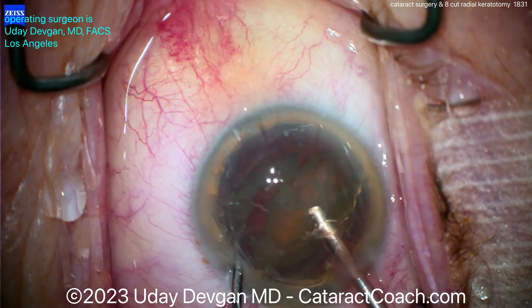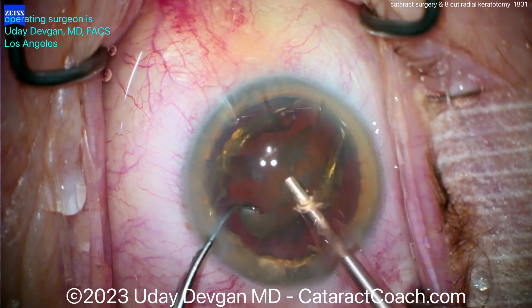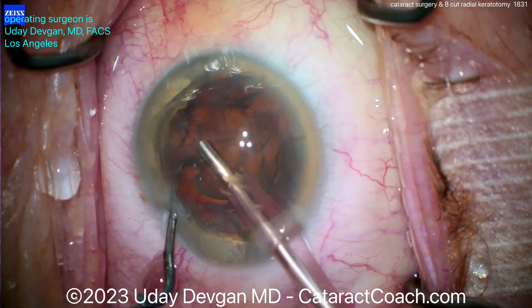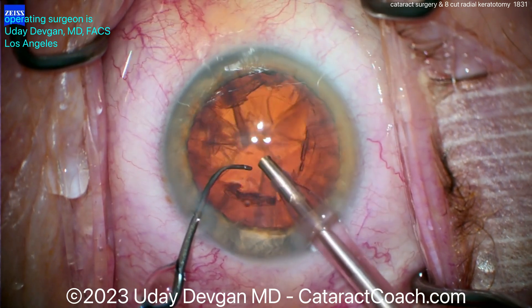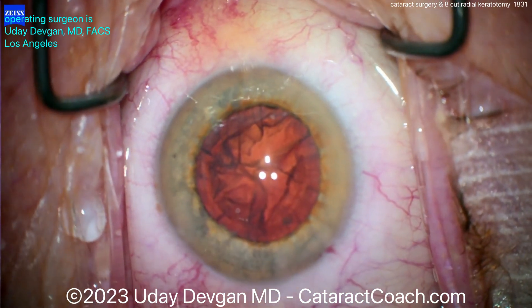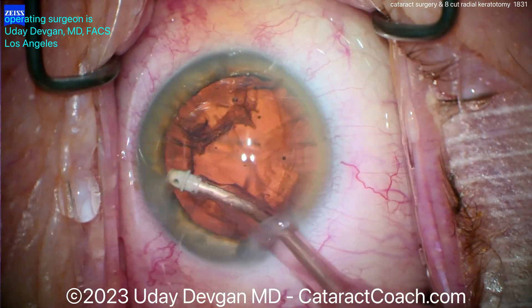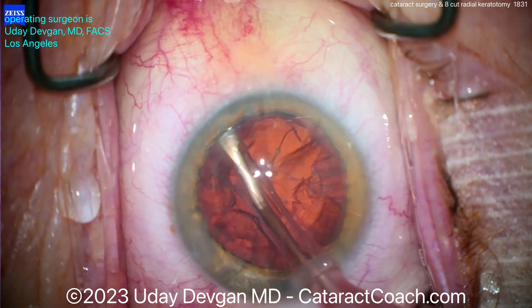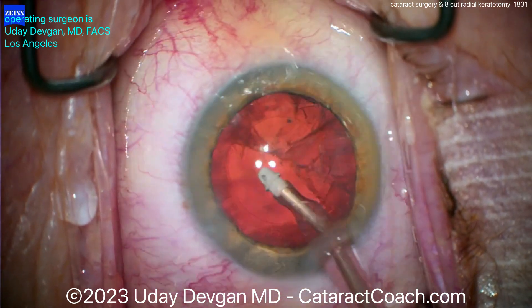These eyes may behave like big myopic eyes, because this patient was myopic before having the LASIK and RK done. Taking these pieces down — in this situation, we're going to implant a monofocal lens aiming for a distance goal, so a plano or emmetropic refractive outcome. Taking out that last bit of lens material — the lens nucleus, epinuclear shell — and that looks pretty clean. Now we can do the cortex removal. Consider what you'd do differently with your parameters: lower the infusion rate so you're not pressurizing the eye so much, and also decrease your aspiration flow rate to keep more stable chamber fluidics inside this eye.